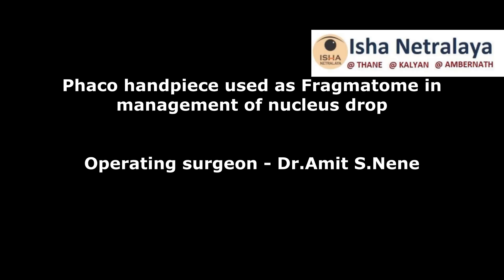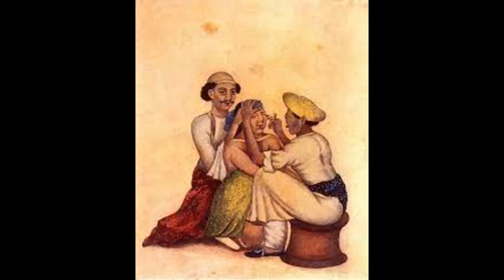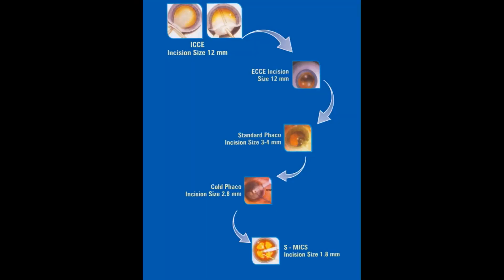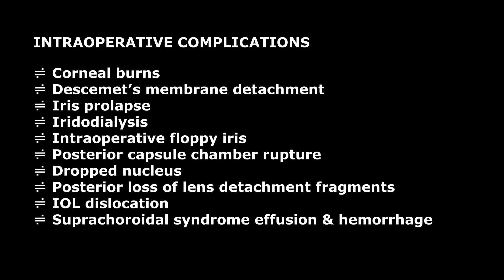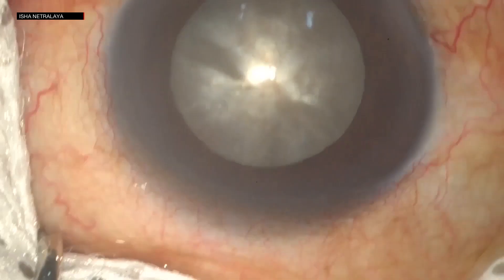This video demonstrates the use of phacoprobe as a fragmentome in the management of dropped nucleus. Cataract surgery has come a long way with the use of phacoemulsification, making the surgery more efficient and safe. However, surgery-related complications like nucleus drop may happen sometimes.